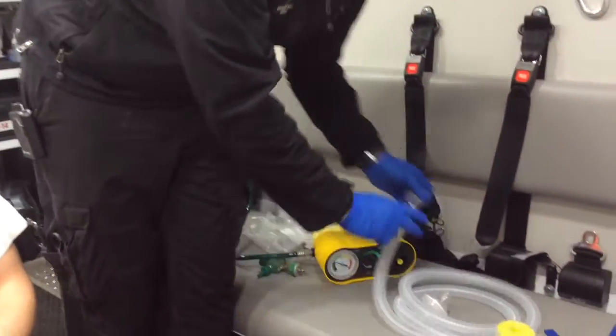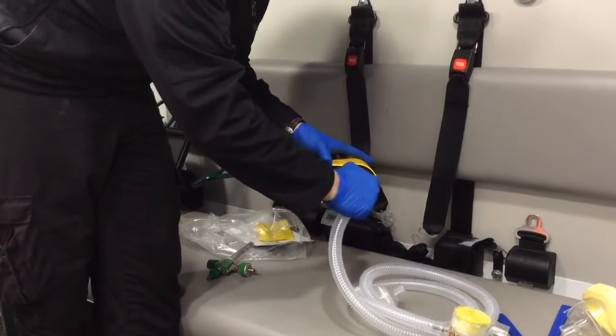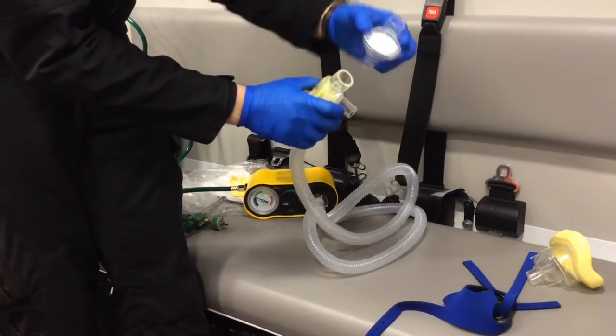We now attach our CPAP hose. It connects by running over and spinning clockwise into the lock. The filter fits on the outside.